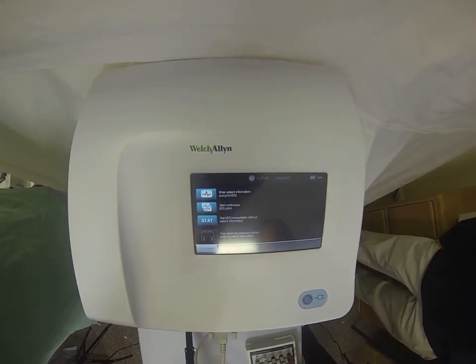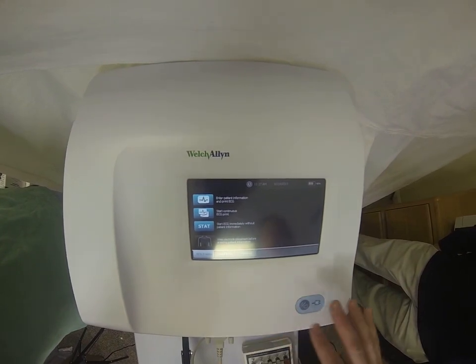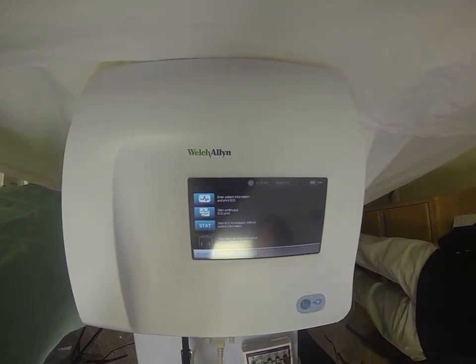Today we're here with the new Welsh Island CP150 ECG machine. This is the first touchscreen ECG on the market, and it gives you a nice 7-inch touchscreen window.